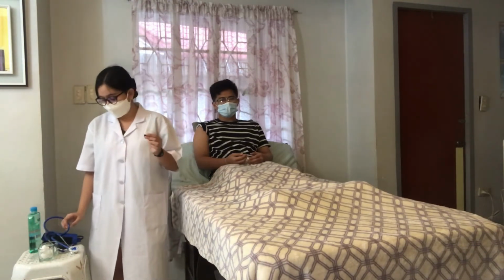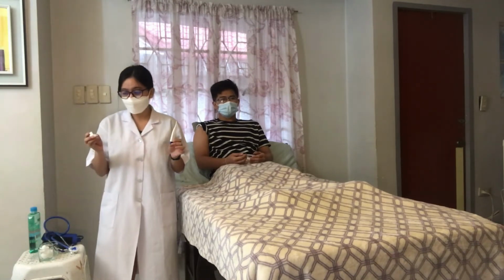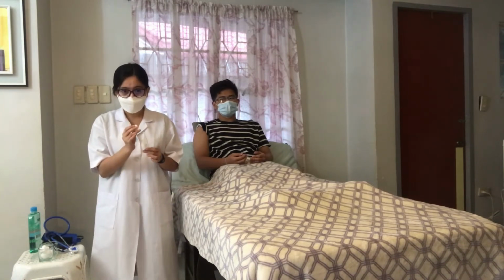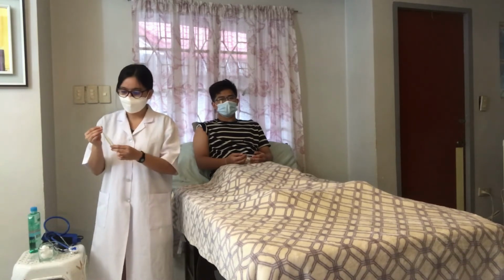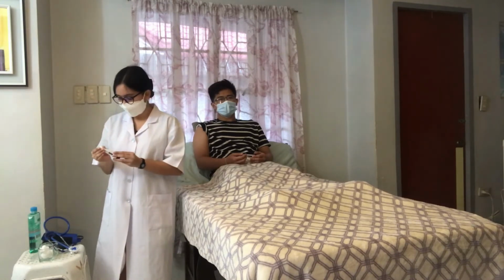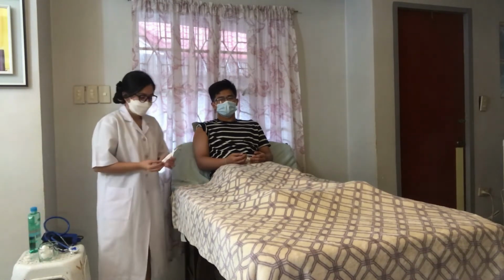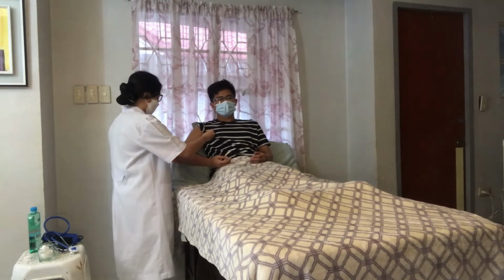In disinfecting the thermometer, we are going to get a cotton ball applied with alcohol and then wipe it from the sensor in a rotating motion down to the neck of the thermometer. Then discard the cotton. And then place the thermometer at the center of the axilla of the patient.